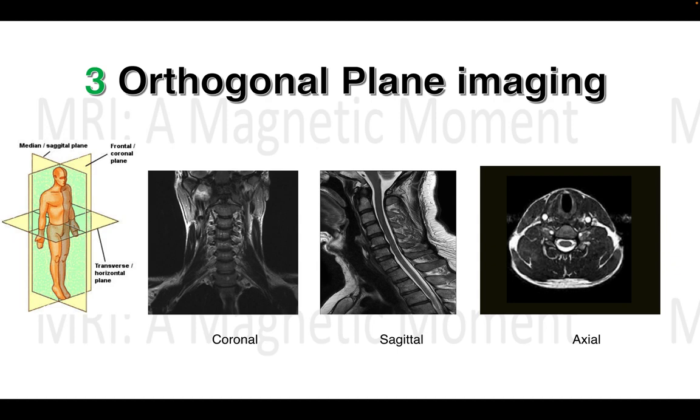But in CAT scan, although we can get transverse or axial imaging, we have to reconstruct them in other planes like coronal or sagittal planes by a process known as MPR, which stands for multiplanar reformation. But initially, we are getting axial images in CT also.